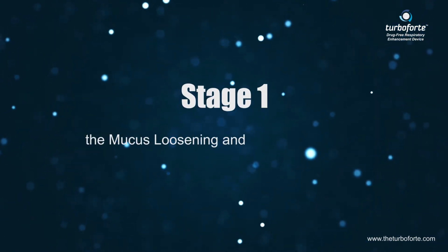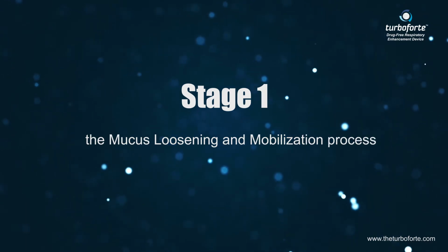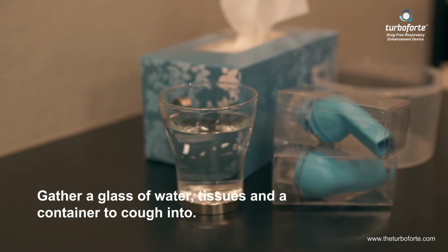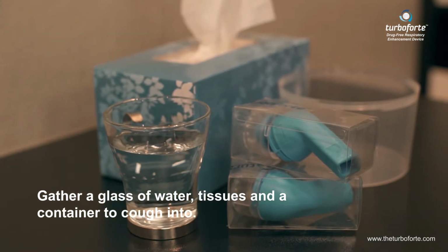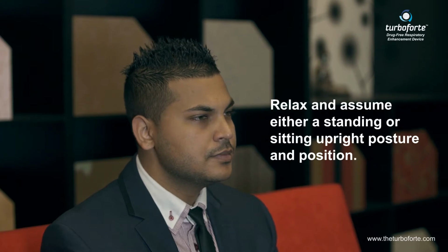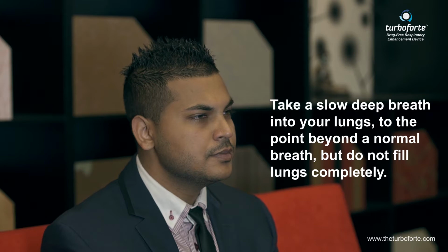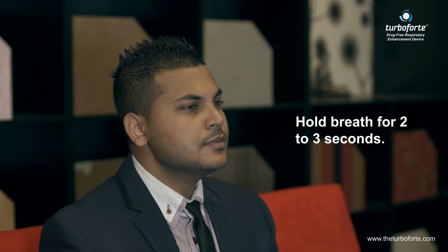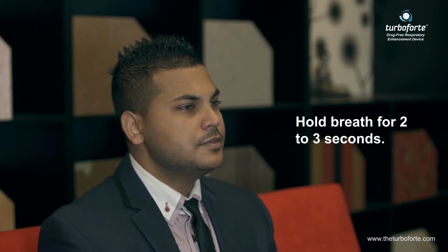Stage 1. The mucus loosening and mobilization process. 1. Gather a glass of water, tissues, and a container to cough into. Relax, and assume either a standing or sitting upright posture and position. 2. Take a slow, deep breath into your lungs, to the point beyond a normal breath, but do not fill lungs completely. 3. Hold breath for 2 to 3 seconds.